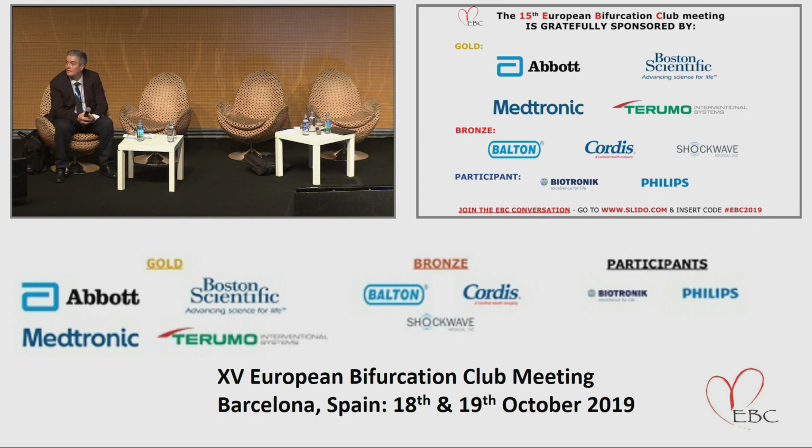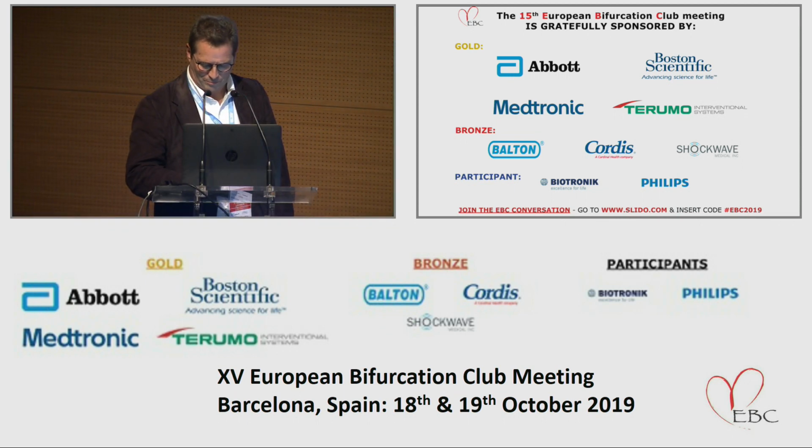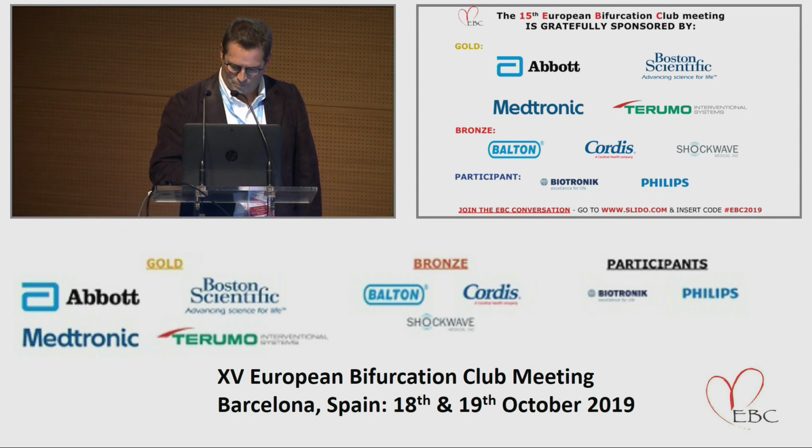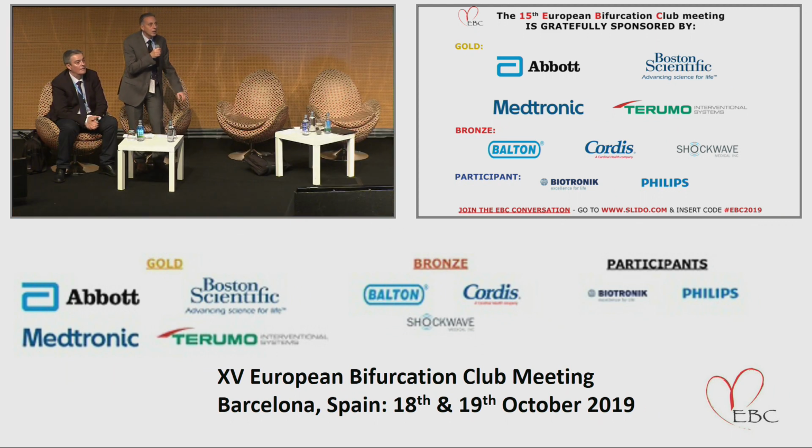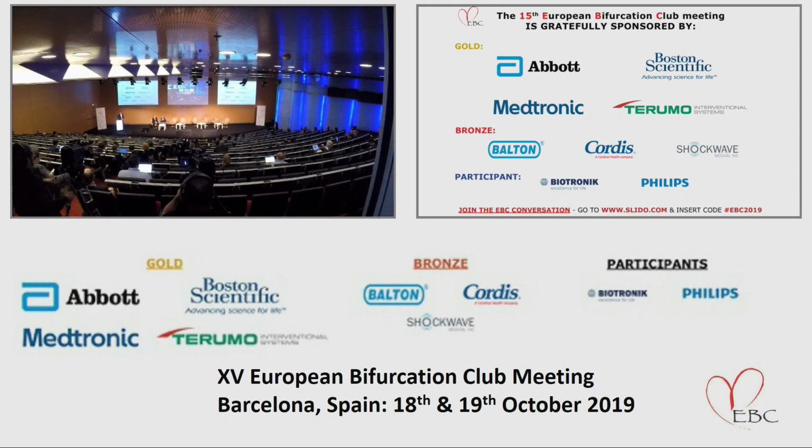One minute. Is the hardware just different from a routine OCT machine? So this is the last release of OCT. Yeah. So it is just a matter of the last software. The acquisition modality is the standard one. What is different to have this 3D reconstruction is the fact that the machine should have the most updated commercial software.